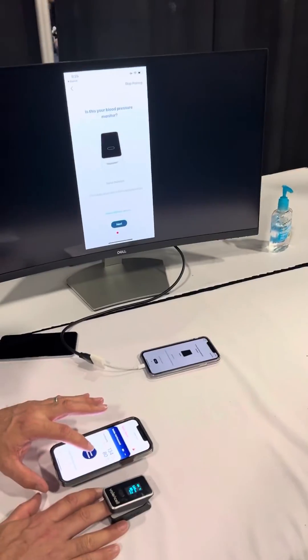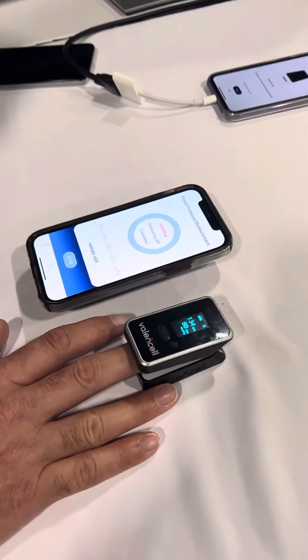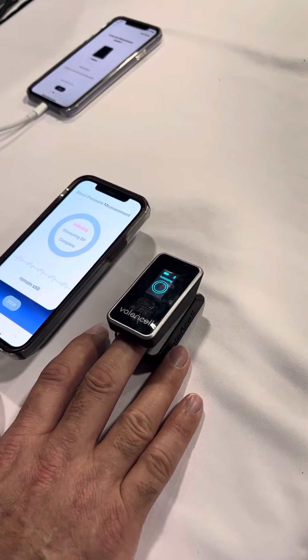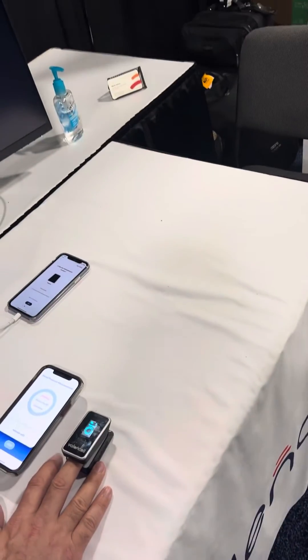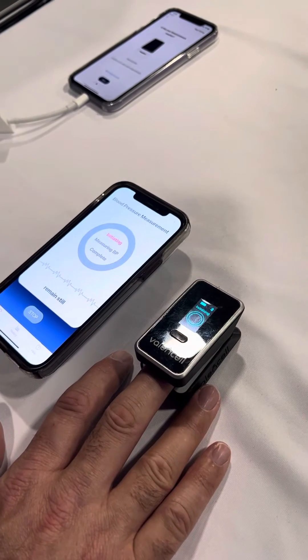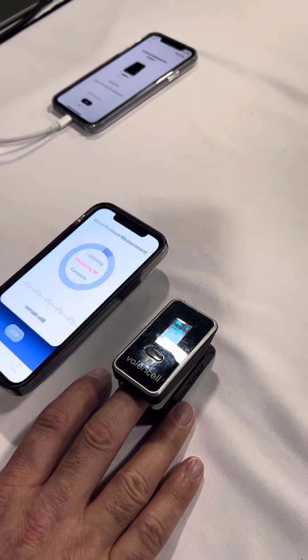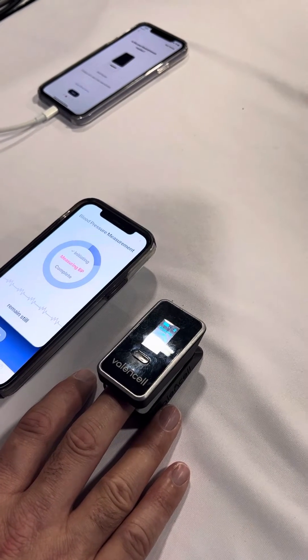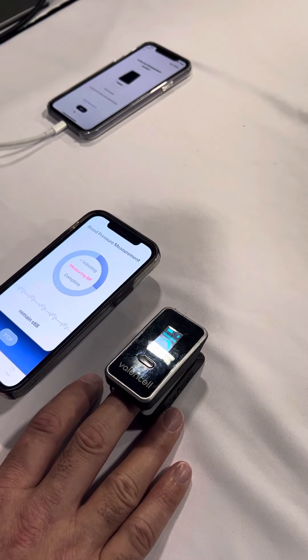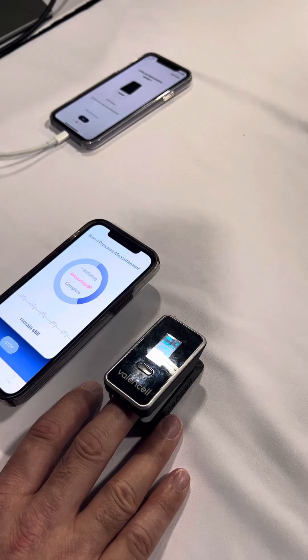It's configured for myself. I'll start a new session. So it takes a few moments to initialize, make certain that there is a finger with blood flow, a live finger inserted, and then you can see it's up counting. It's collecting data about 30 to 40 seconds, similar duration as a cuff reading.